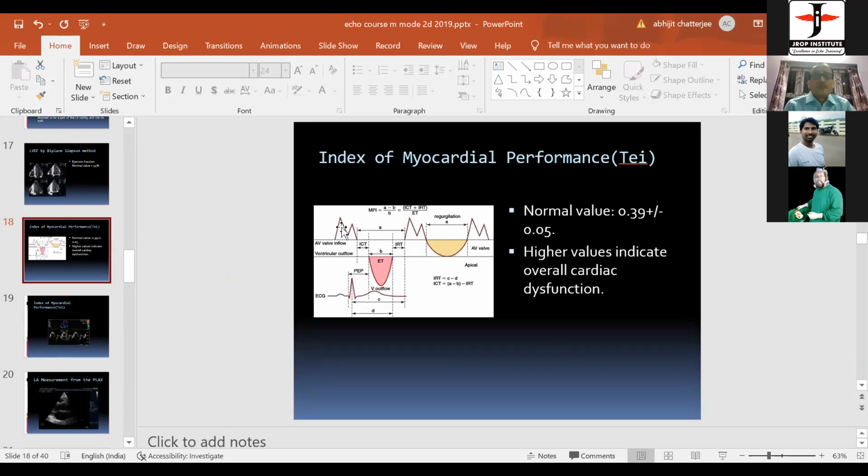This is the mitral valve flow. Again, next cycle, this is the mitral valve flow. And this is the aortic valve flow. The mitral valve flow ends, and there's a small gap, and the aortic flow starts. So during this small gap, the ventricle is contracting well, but both the valves are closed. So this is isovolumic. The volume does not change, but the pressure rises. And when the pressure rises, the aortic valve opens and ejects blood.